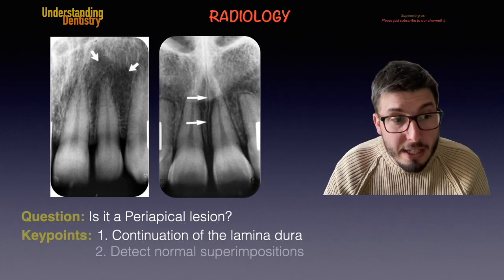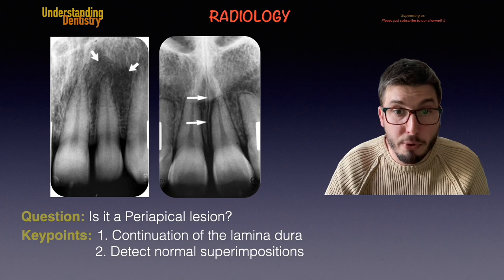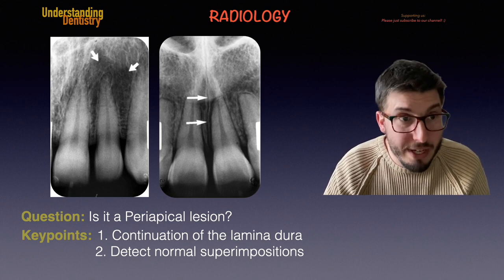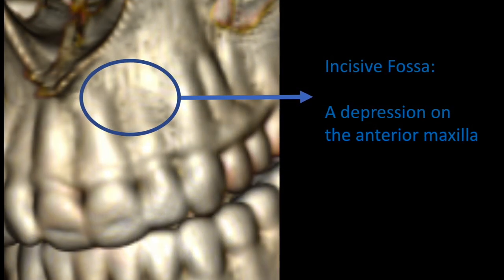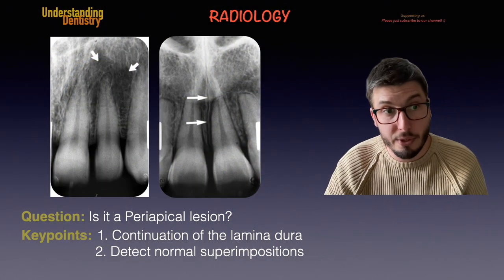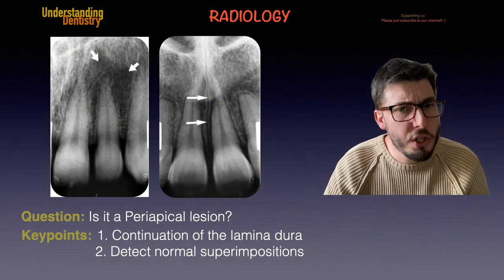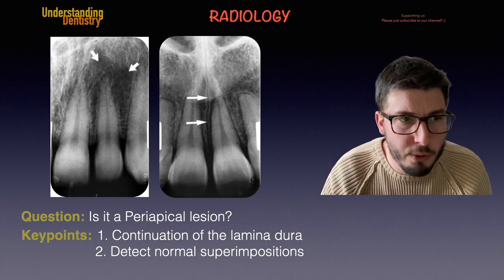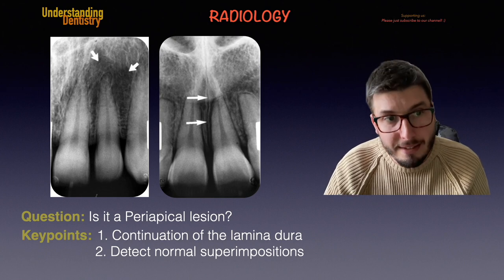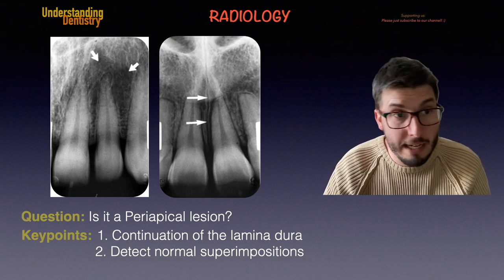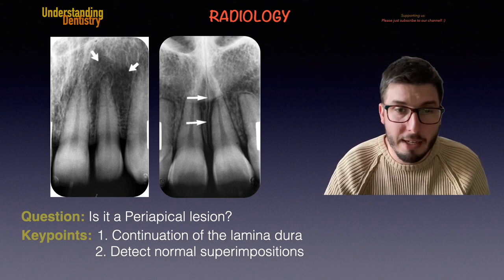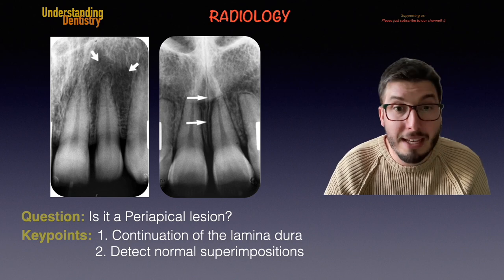The second key point is to detect the normal superimpositions that are expected in this region. In the radiograph on the left, we are seeing the incisive fossa — it's not a lesion. There's also the canine fossa close to but distal to this area. How can we be sure? Again, we follow the shape of the lamina dura, which is surrounding the entire apex. The incisive fossa can show as a radiolucent area because there is less bone in this area.